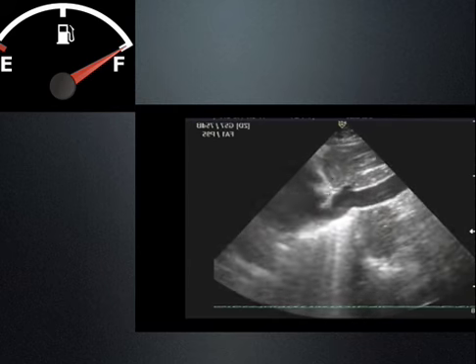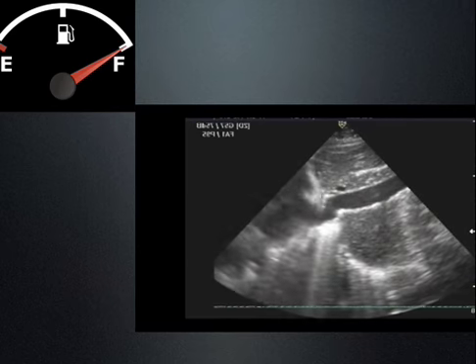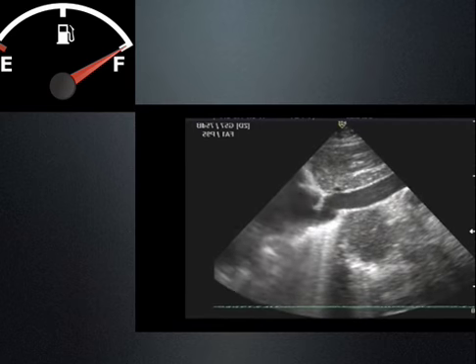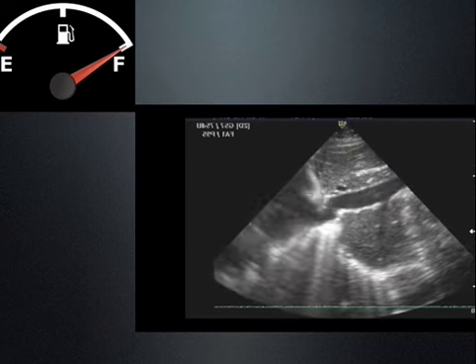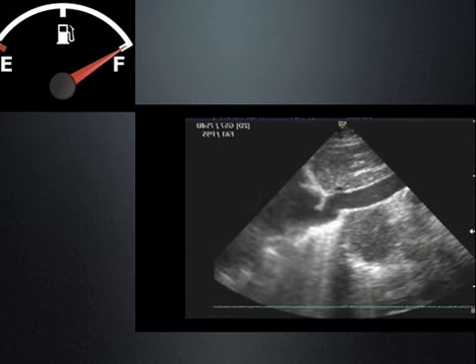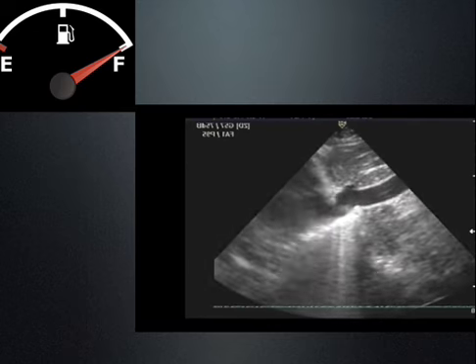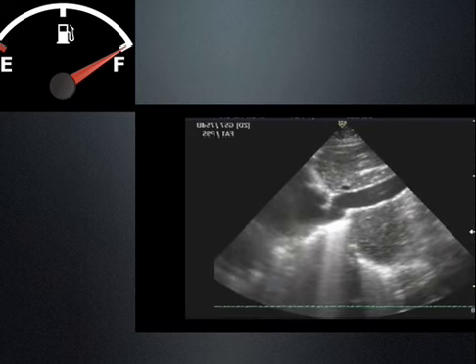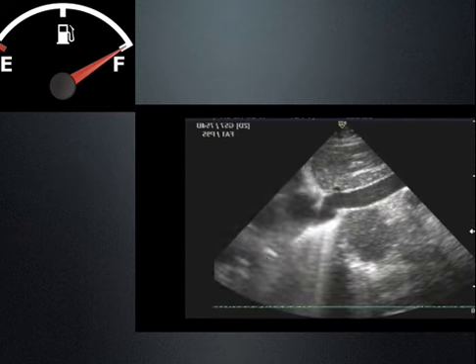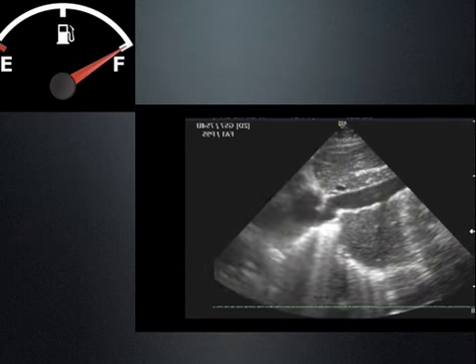All right? And the reason that's important is because if you look right here, the diaphragm oftentimes will tether open the IVC, so it's a less reliable place to look. And if you start getting further down towards the feet, the IVC is also very highly compliant. You have the liver that's pressing on it. And not lastly, and probably most importantly, most of the studies looking at this are looking right here. So that just goes with all the other studies.